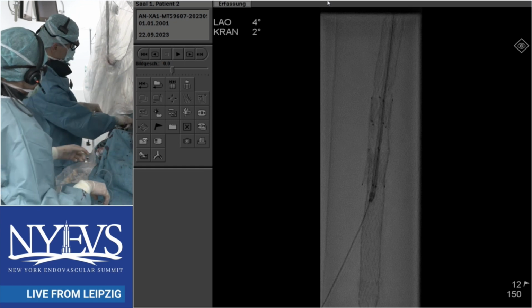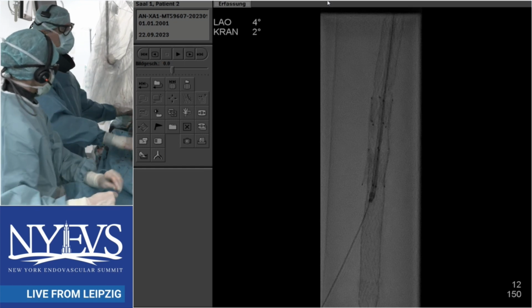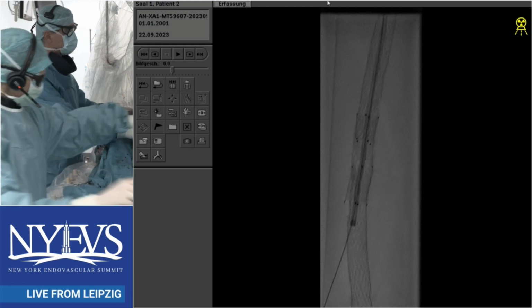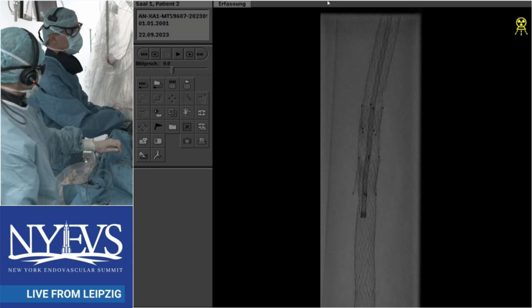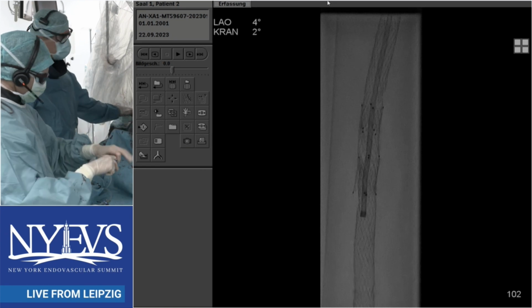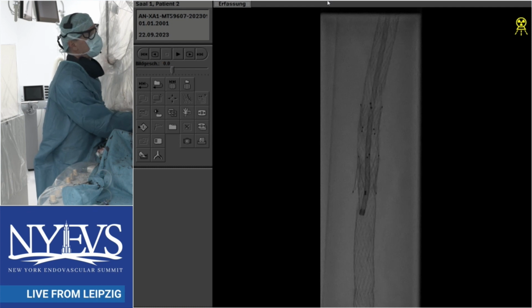So Chris, I understood what you're saying, but if you're able to do it safely, like you said, with a tier 1 operator, would you encourage us to go after these lesions, knowing what you said about the natural history of claudication? I think at the end of the day, if your patient completely understood and you can sleep at night knowing that you did everything right, absolutely. Okay, I think we agree.